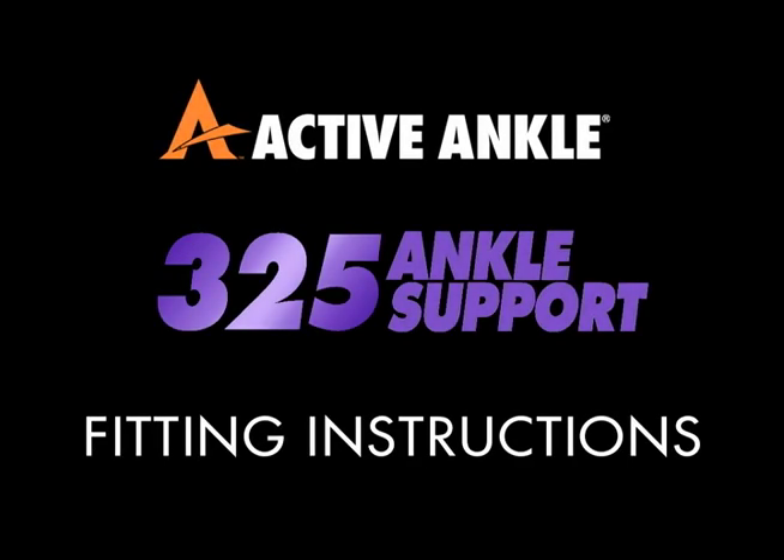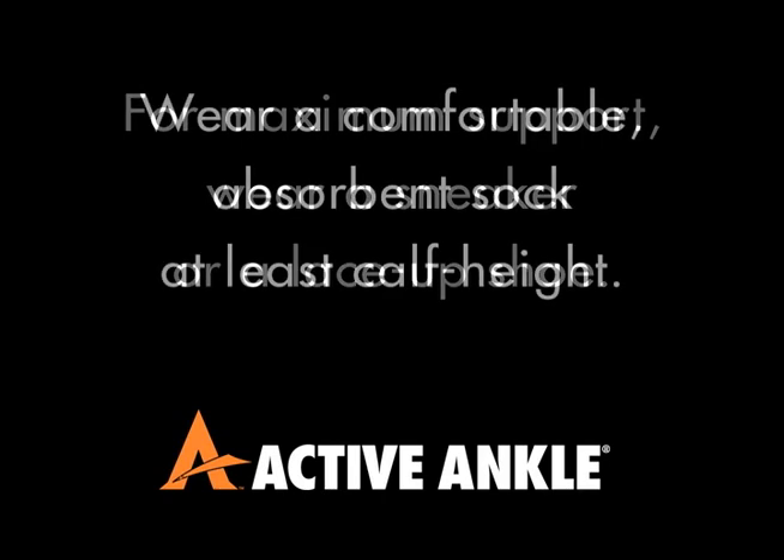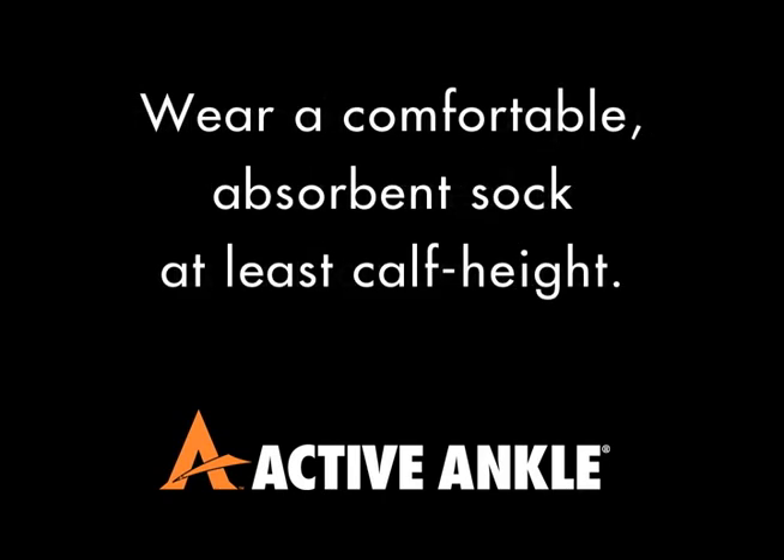These are the fitting instructions for the Active Ankle 325 ankle support. This support will fit your left or right ankle. The 325 ankle support is designed to wear over an athletic sock.